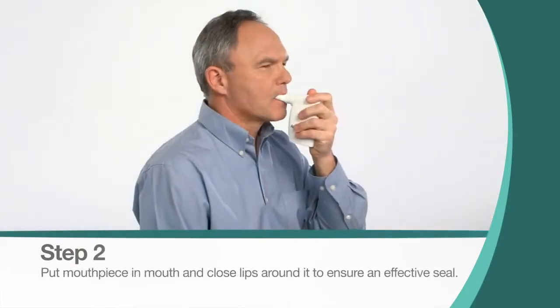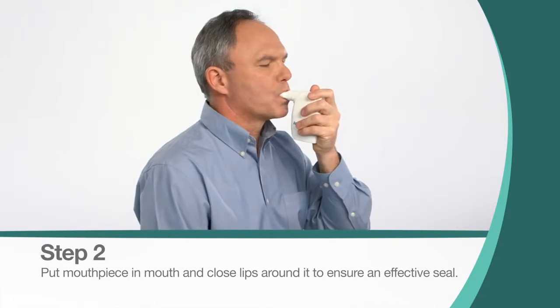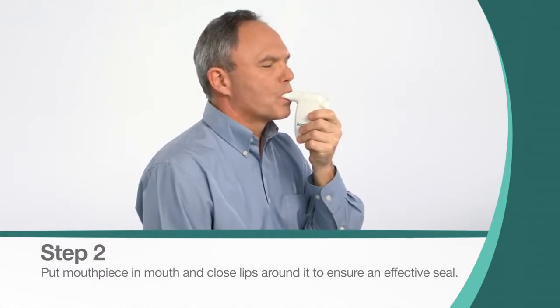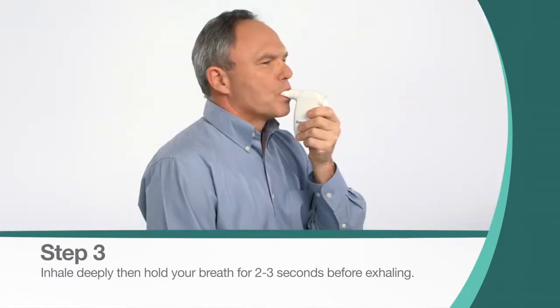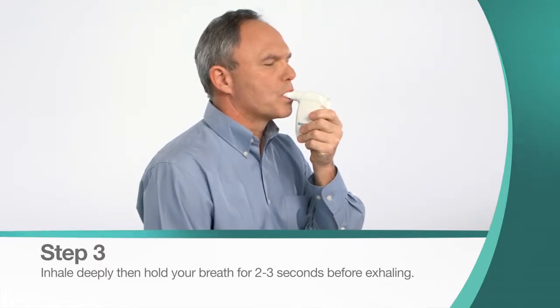Put the mouthpiece in your mouth, closing your lips around it, forming a good seal. Make sure your hand does not block the exhalation path on the back of the device. With your lips still sealed around the mouthpiece, inhale deeply. Then hold your breath for 2 to 3 seconds before exhaling actively, but not forcefully, through the device.